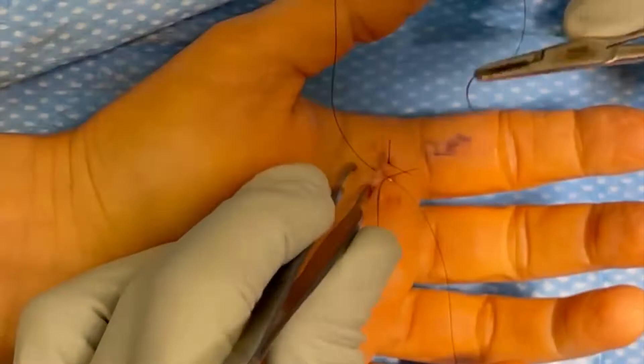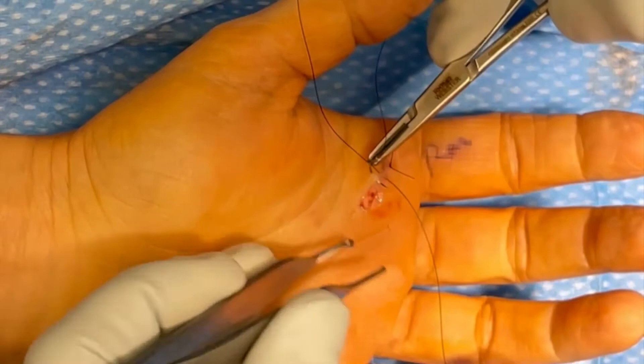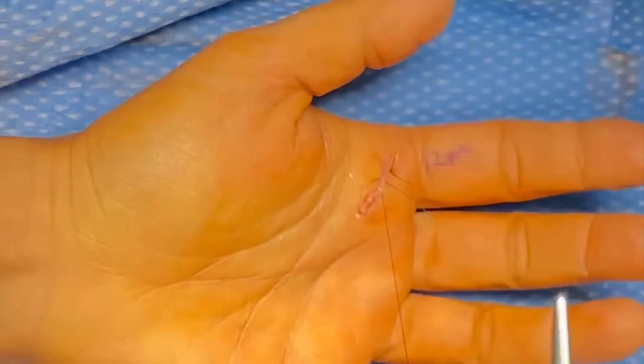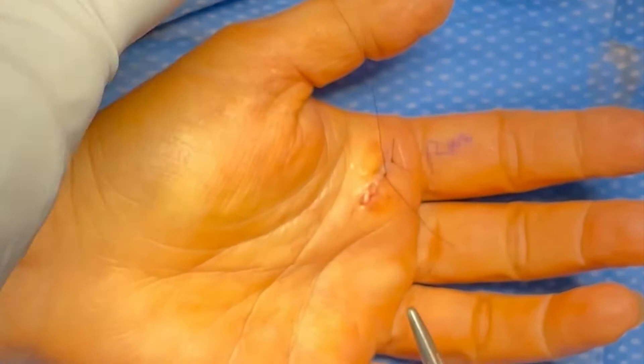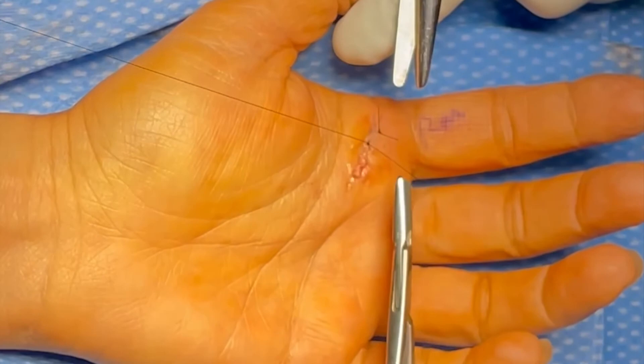The suture being placed is a 5-0 nylon in a horizontal mattress technique. This horizontal mattress is a good way of everting the skin edges — making them kiss each other head on — which takes a lot of tension off the wound and gives you a nice cosmetic closure. We tend to take out the sutures in approximately one week. The 5-0 nylon is a relatively inert suture that doesn't cause a lot of tissue reactions. The assistant is cutting the sutures with a straight Mayo-type scissor.